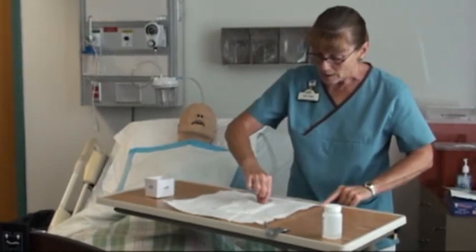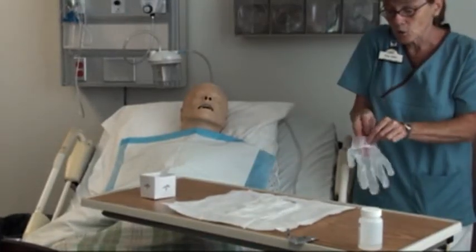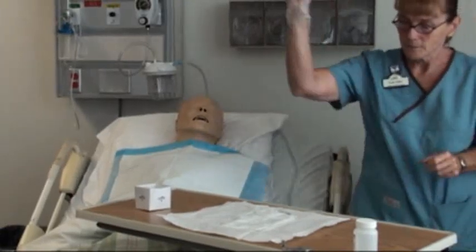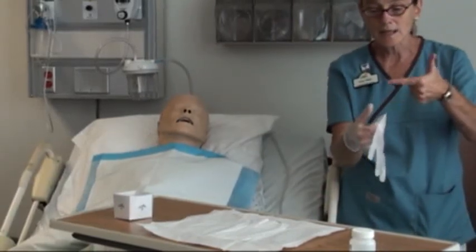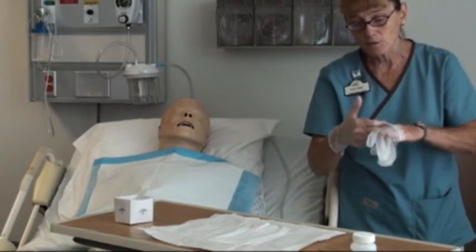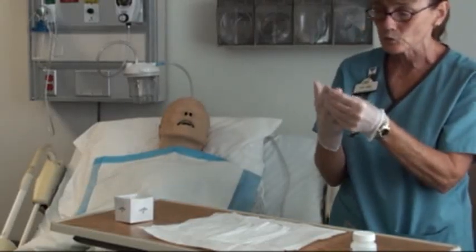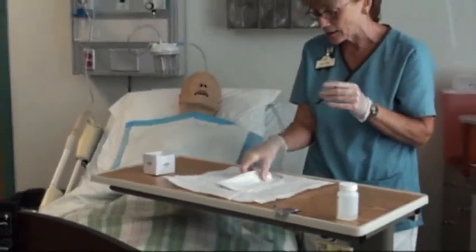One-inch margin — I can put my finger in. I'm going to reach in and pick up my glove, step back off my field, and go ahead and put my hands in. Notice I keep my hands above my waist. Once I get ready to put my hand in, I'm going to abduct my thumb or hitchhike, and step back off my field so I wouldn't contaminate anything. Sometimes the gloves don't go on the way you want them to and you may have to sort your fingers out. Before doing anything else, look and make sure you've got everything you need.